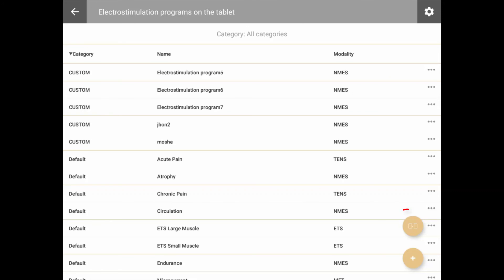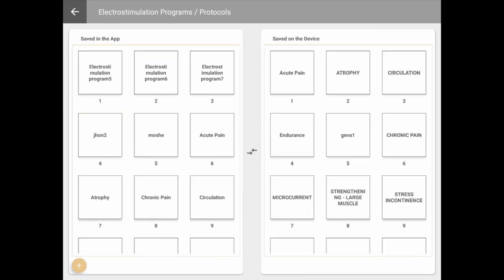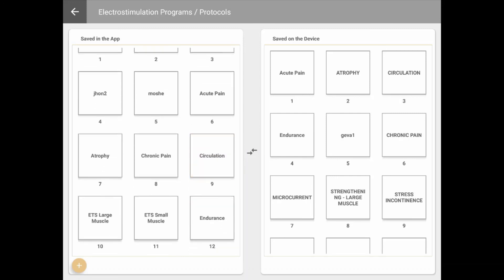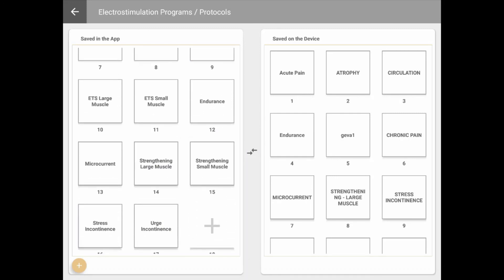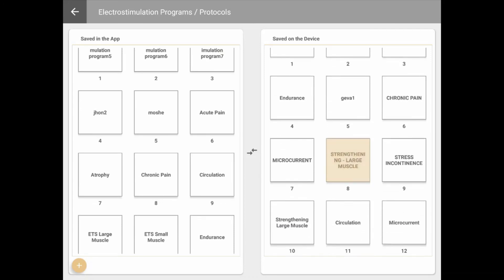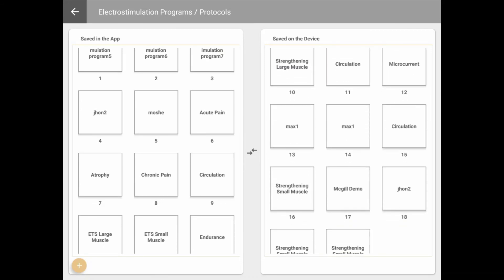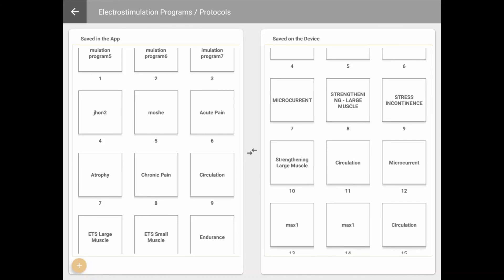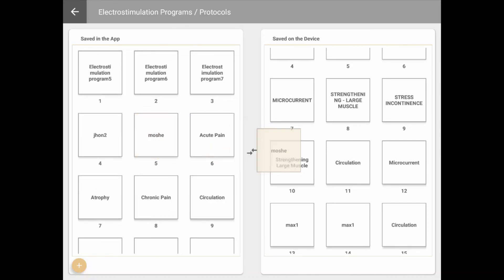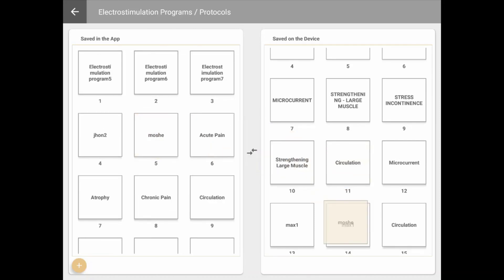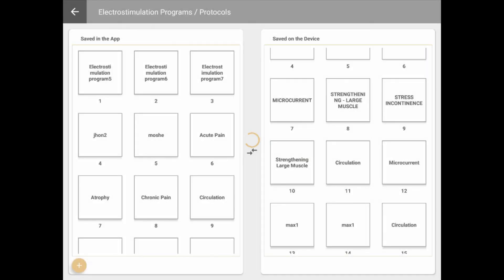From the Programs menu, click on the To Windows button at the bottom of the screen to display the program's Upload/Download screen. On this screen, you will see two program lists: on the left are all the programs saved on the tablet, and on the right, a list of all the programs saved on the Mionics device itself. From here, you can drag and drop to copy programs from one device to the other, as well as change the order of the programs on the Mionics device.